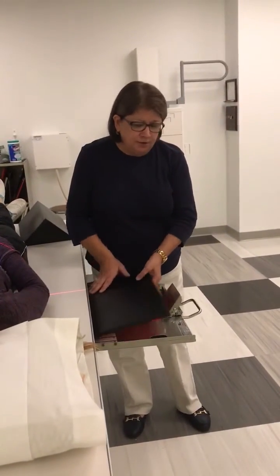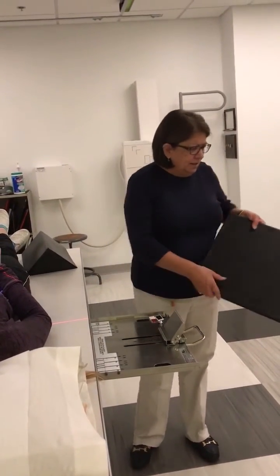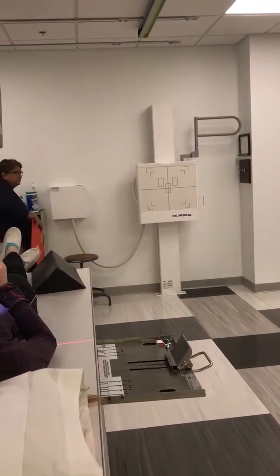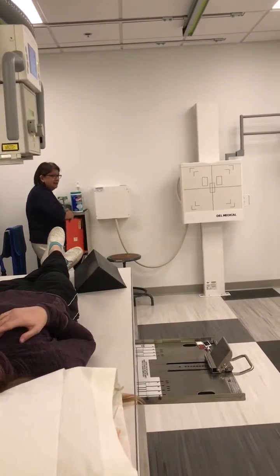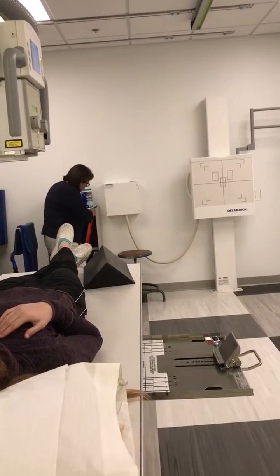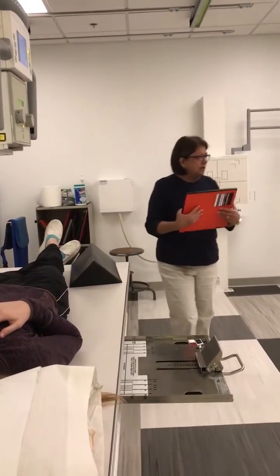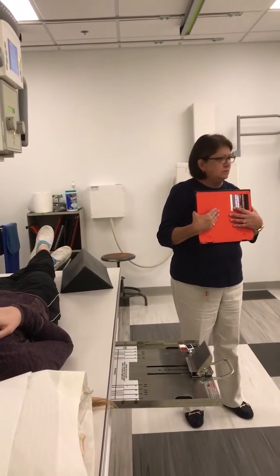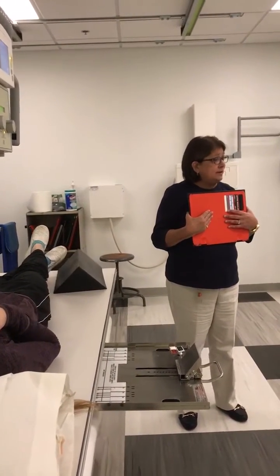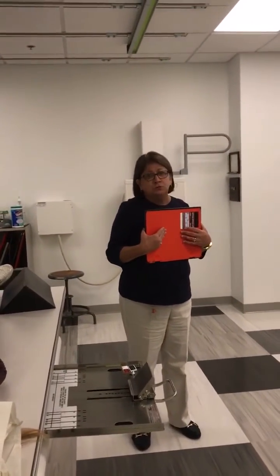If you took that image, and when you reviewed it, you saw that the right kidney was overlapping the spine somewhat, what would your positioning error be? You over-rotated? Rotated too much. Over-rotated, which is easy to do.